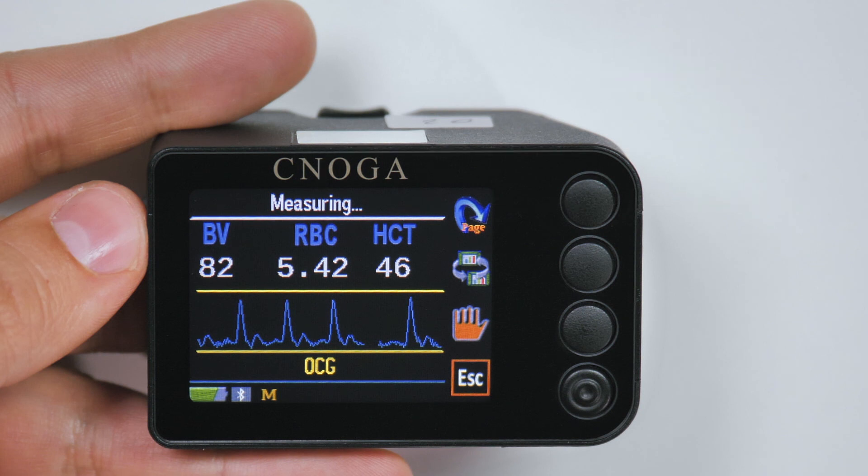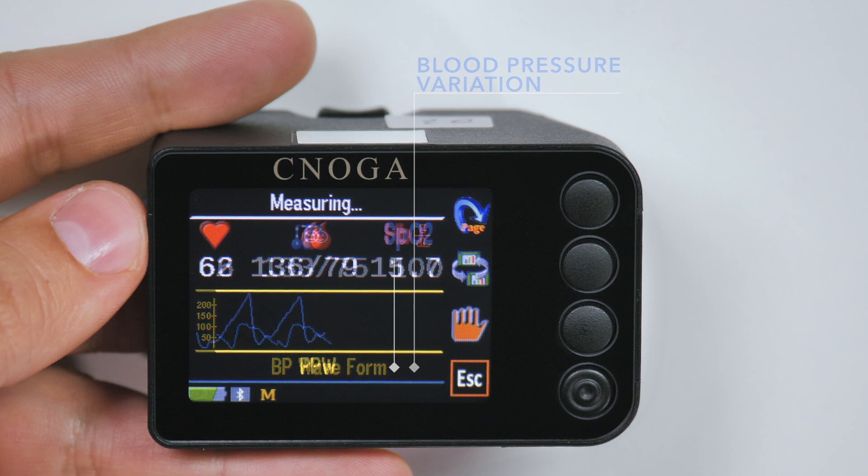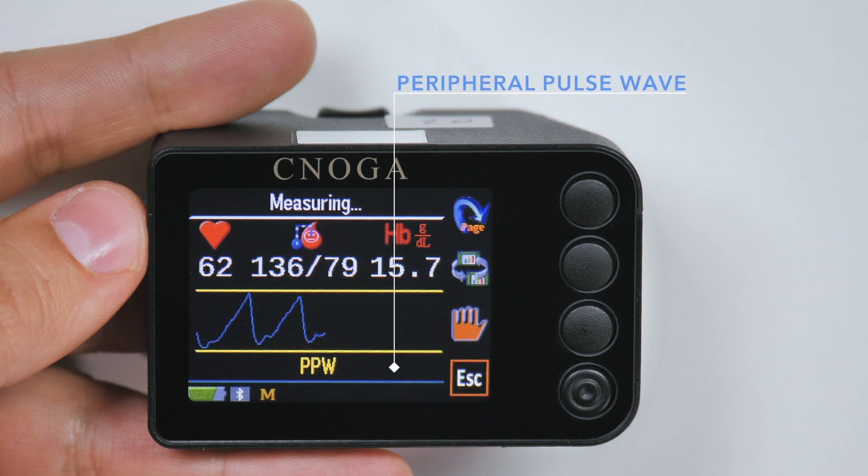In addition, during the measurement, the device will display informative graphs such as optical cardiogram, blood pressure variation, and peripheral pulse wave.